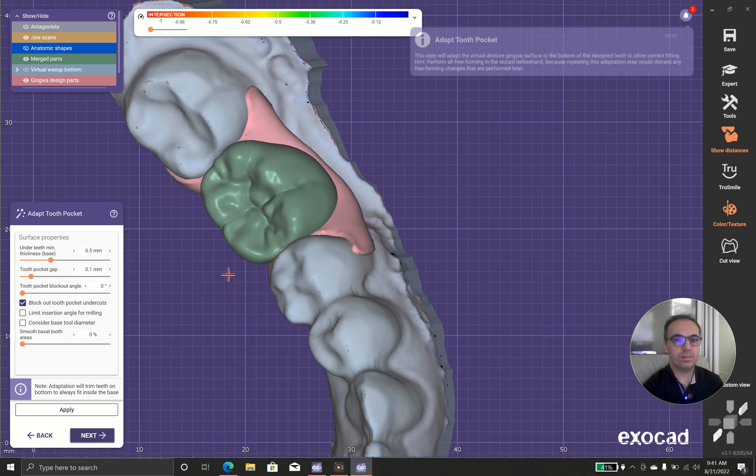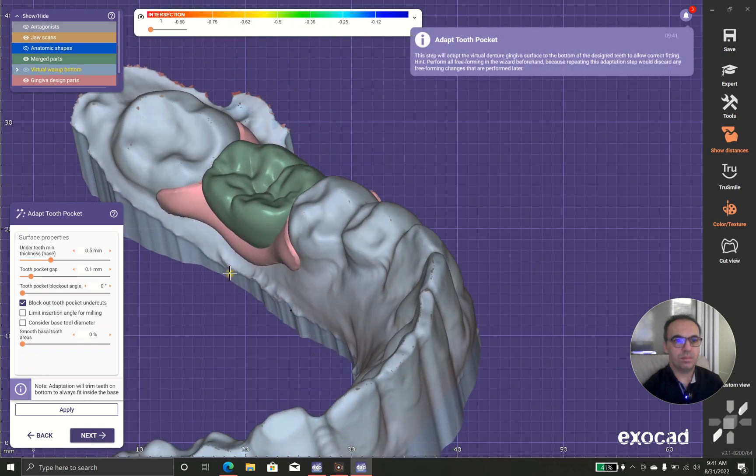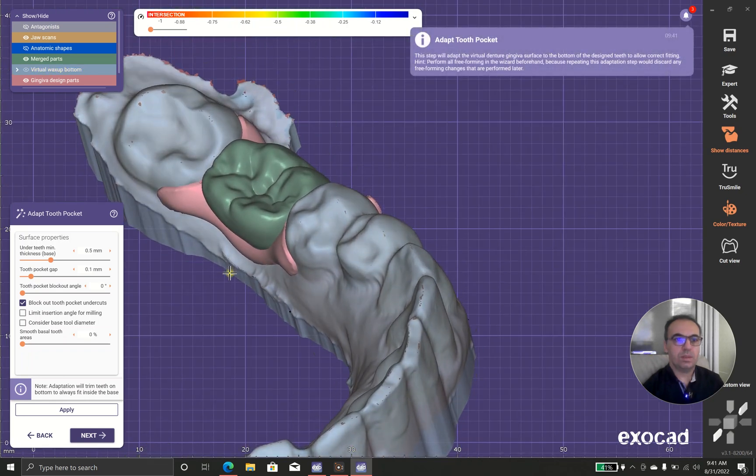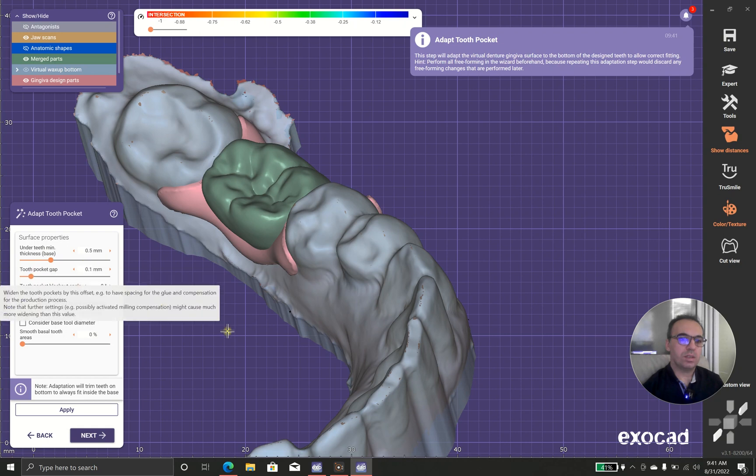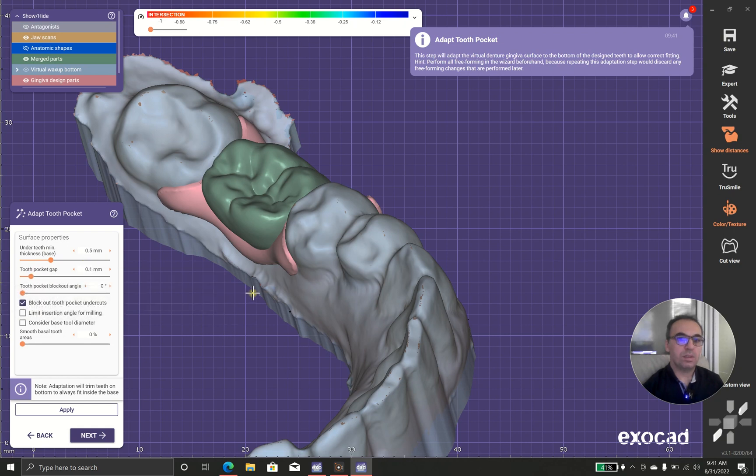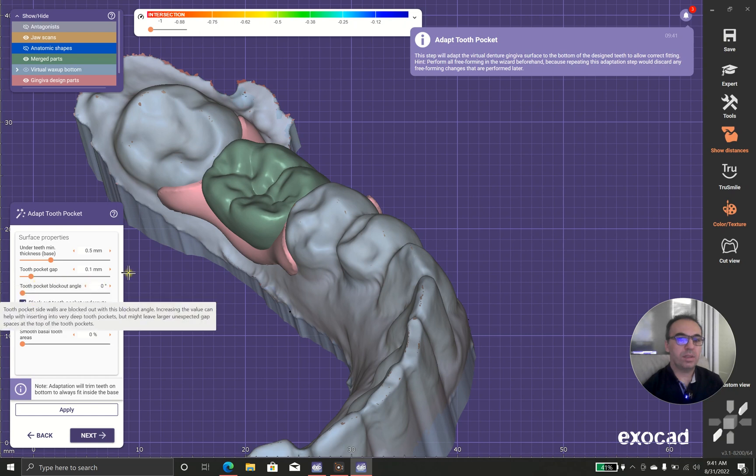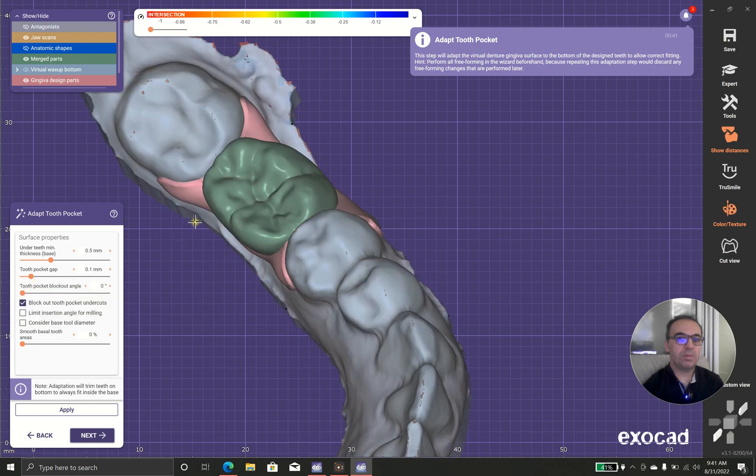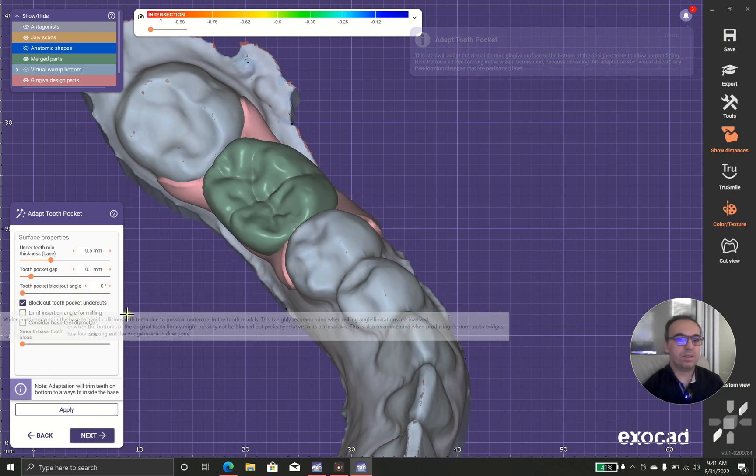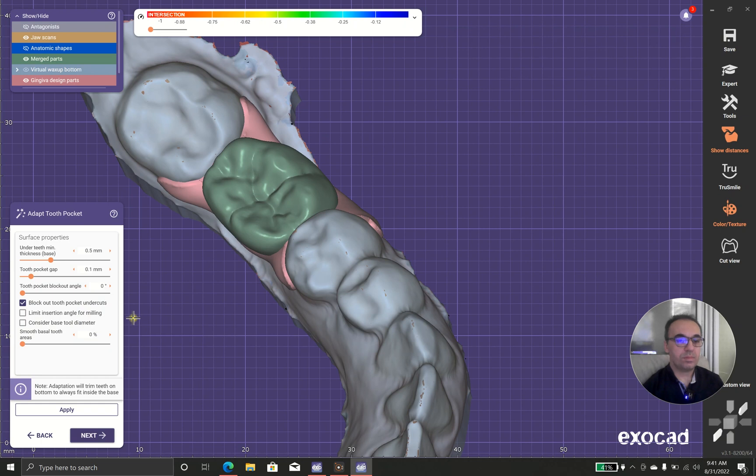Okay. Now it says how much undercut under the teeth and the tooth pocket gap. Because I want to have this as one unit, I prefer not to have any gap.